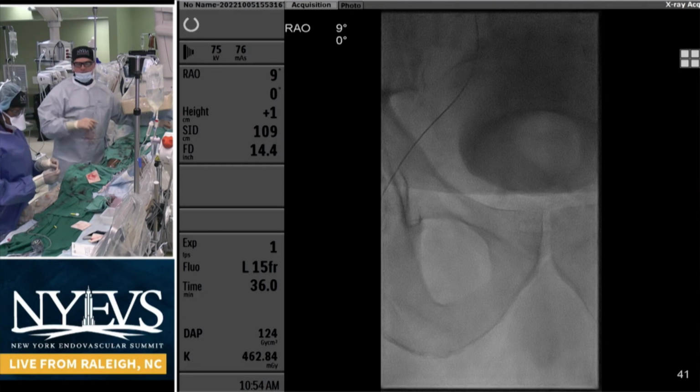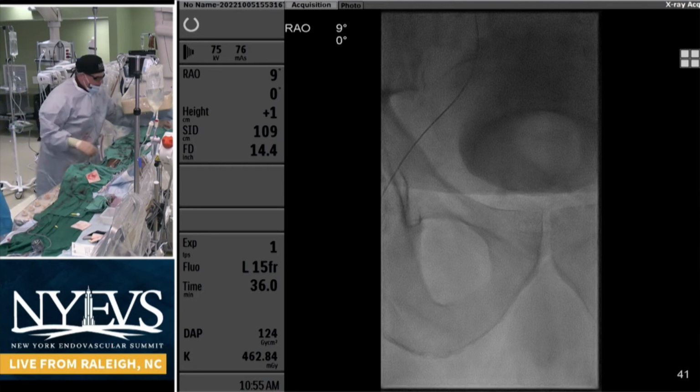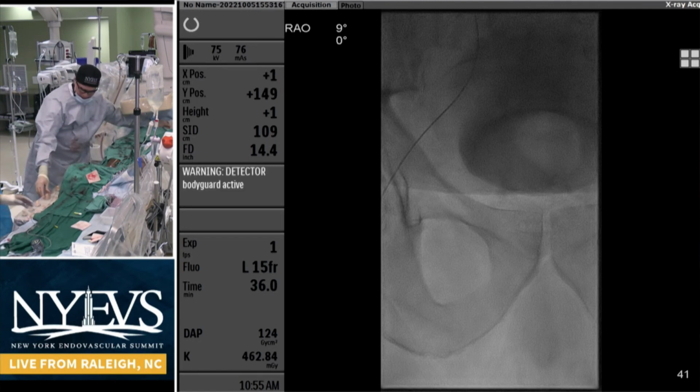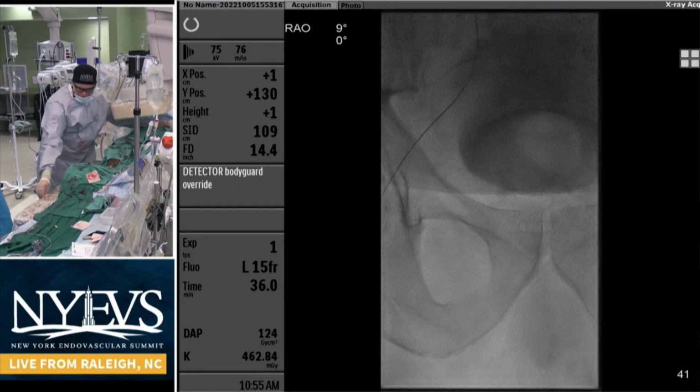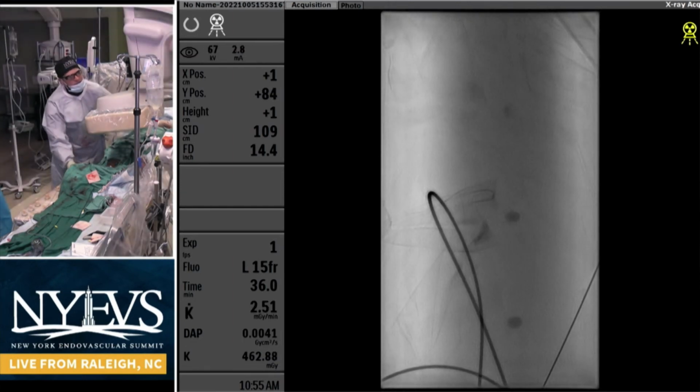Take out your dilator. All right, so what we've got now is I put in a 5 French sheath from below, and I think you can appreciate, hold on one second. So what I did is I took a 4.0 x 200 Ranger drug-coated balloon from below. I think we're in the true lumen in the TP trunk AT communication. I think it was more spasm than anything. I'm just going to show you this.